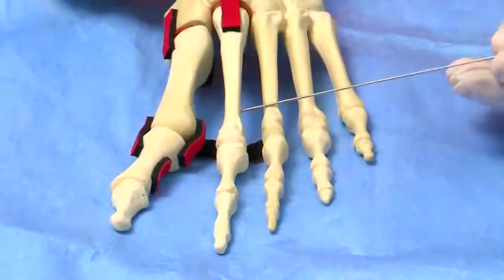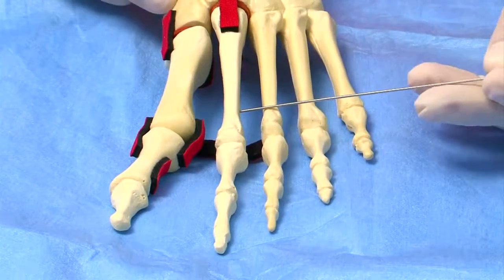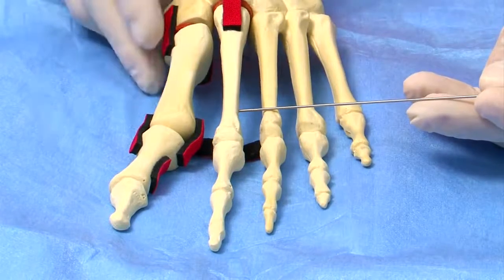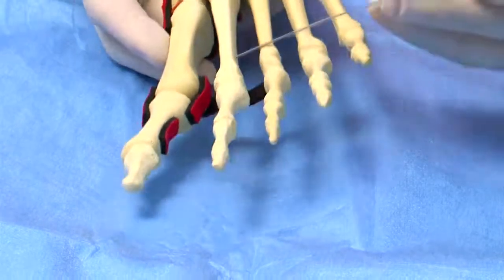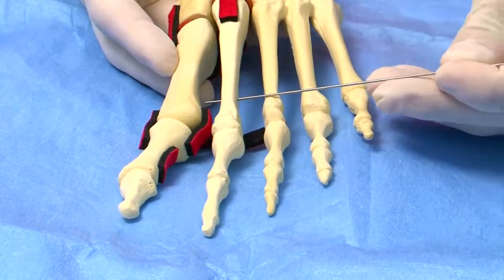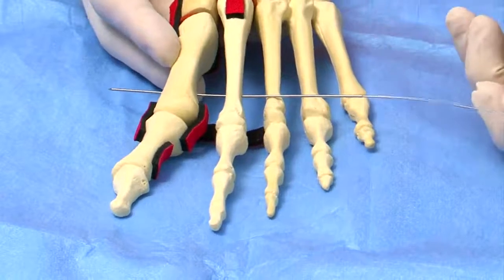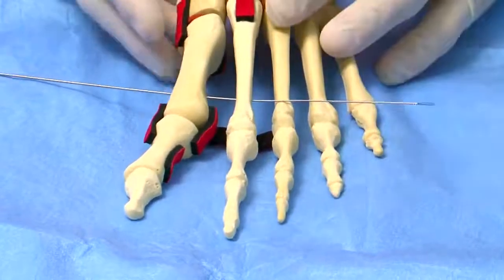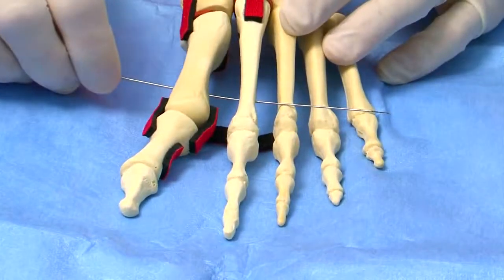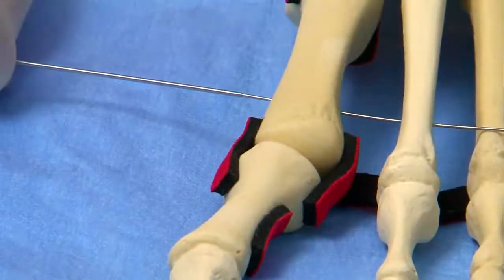The 1.1 millimeter guide wire is then passed in the normal fashion from the second metatarsal into the first metatarsal, taking care to place the guide wire in the central aspect of the second metatarsal. Once it is passed all the way through both metatarsals, so the graduated portion is through the first metatarsal, you are ready to pass the mini TightRope.